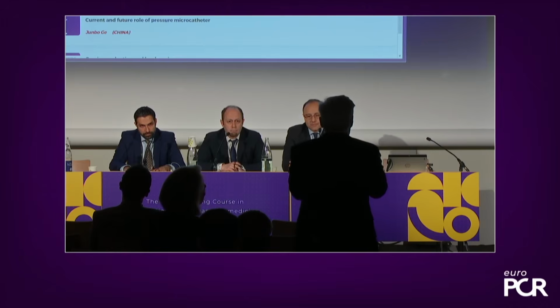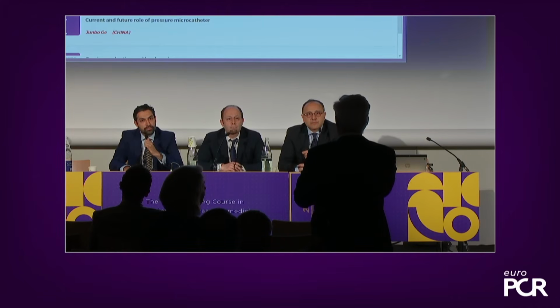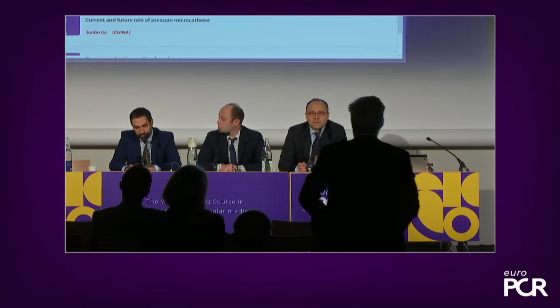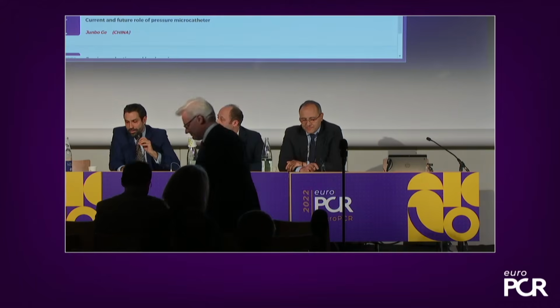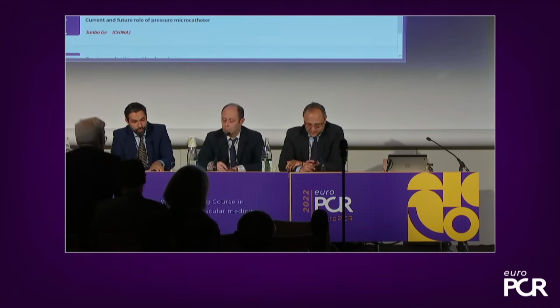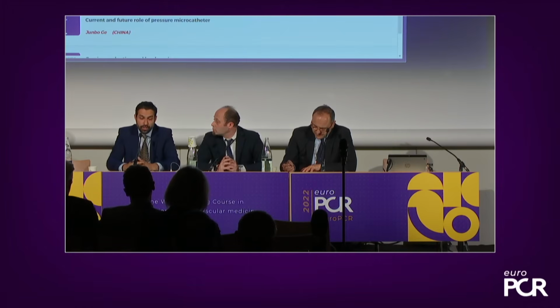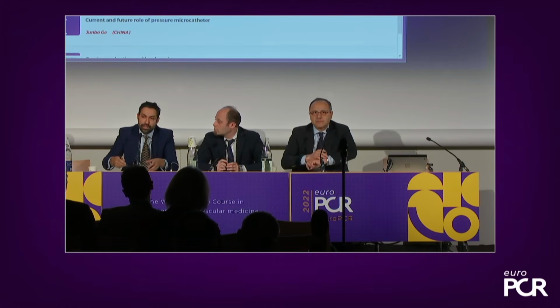I have one question to you regarding this hyperemic pressure pullback. Why don't you use just the rest pressure pullback? That's a very good question. So we have understood that there are a lot of advantages of using resting conditions to measure coronary physiology. One of them, of course, is the absence of adenosine, waiting for hyperemia, time, cost, etc.